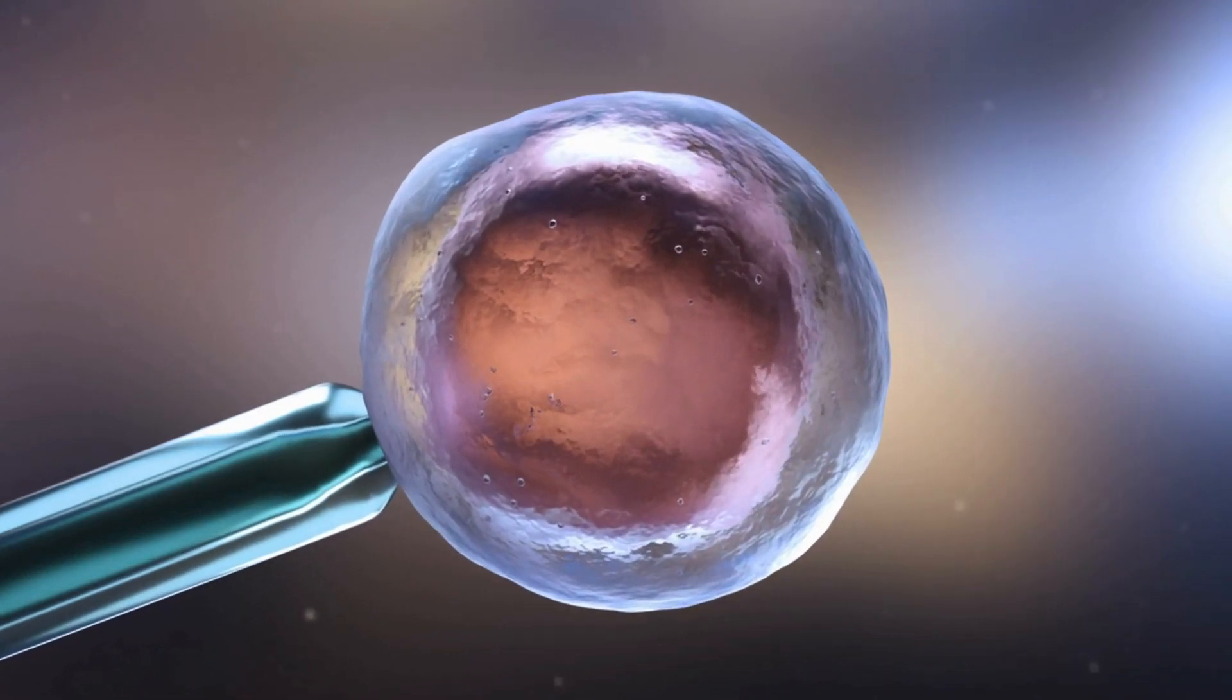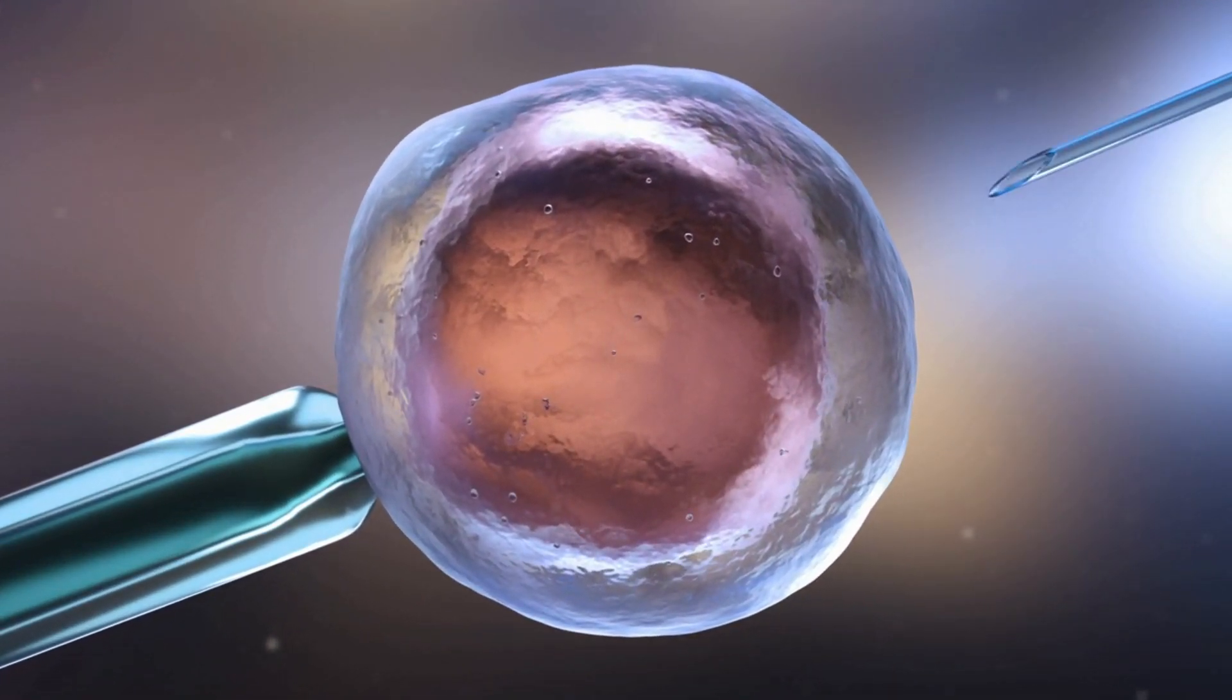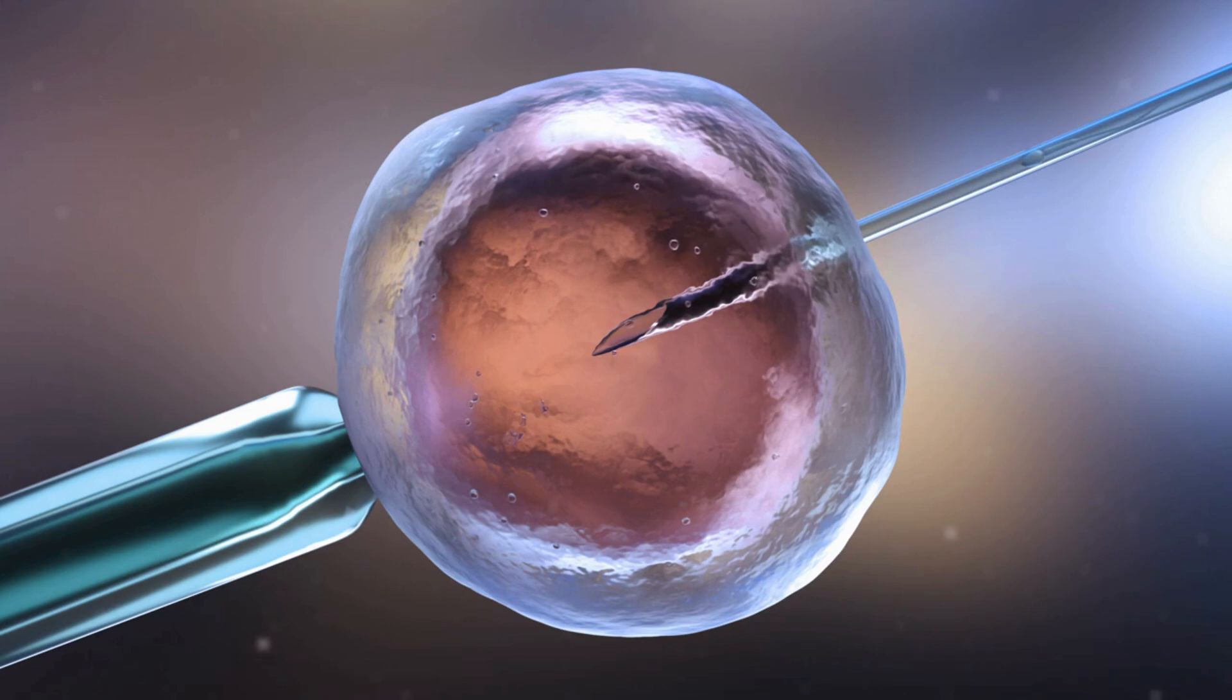Oocyte retrieval, also known as egg retrieval, is a medical procedure used in assisted reproductive technologies like in vitro fertilization, IVF.